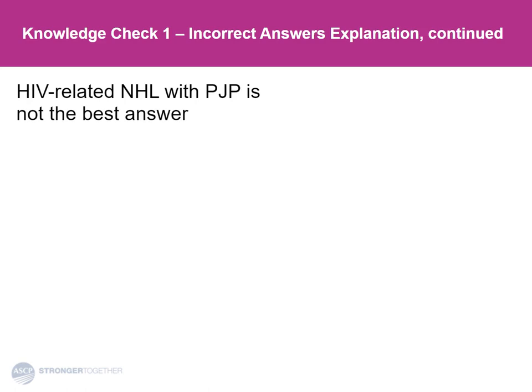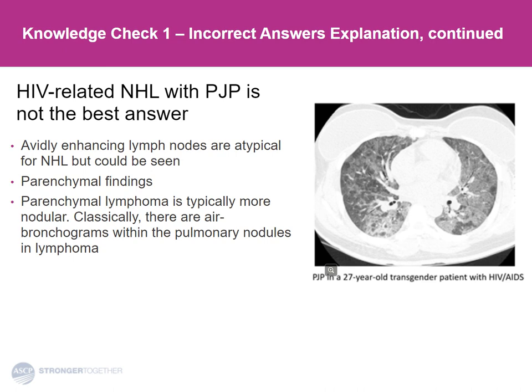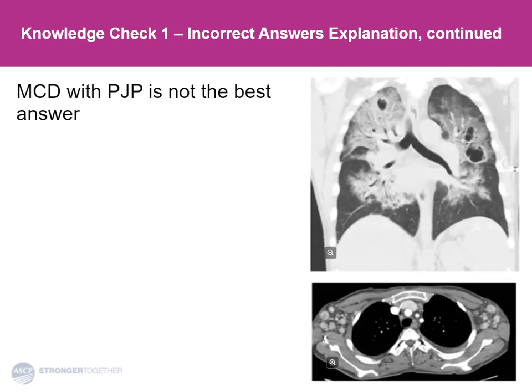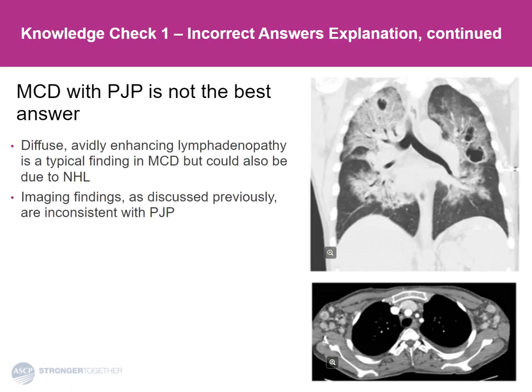What about non-Hodgkin's lymphoma with pneumocystis pneumonia? The parenchymal findings really don't look like pneumocystis. This is what pneumocystis classically looks like — a 27-year-old transgender patient with HIV, uncontrolled with AIDS. You can see the diffuse ground glass, some areas of lobular sparing, and if you look very closely, it almost looks like a mesh framework within the areas of ground glass, which is what we call a crazy paving pattern. Here is a patient with multicentric Castleman disease and pneumocystis pneumonia — avidly enhancing lymph nodes from the Castleman disease, but with pneumocystis pneumonia showing ground glass with crazy paving, and cystic change, which we occasionally see with multiple episodes of pneumocystis. So the best answer for that case really was multicentric Castleman disease and Kaposi's sarcoma.